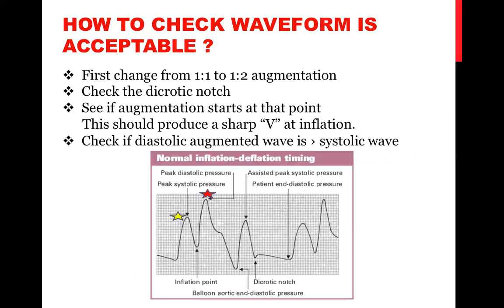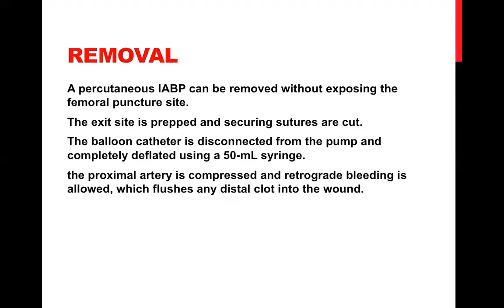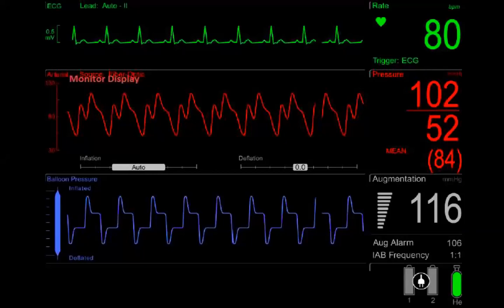The monitor is reading one beat. So if there is a premature ventricular contraction, the blood pressure will reflect on that beat. Yes, so actually what the monitor measures for the 102 is the highest normal systolic according to the ECG, the normal systolic wave. So it may change from one beat to another.